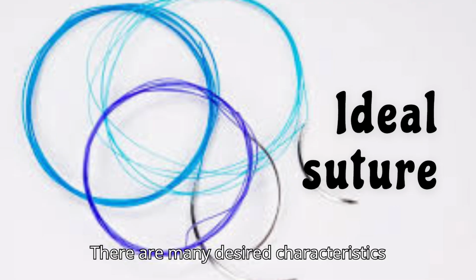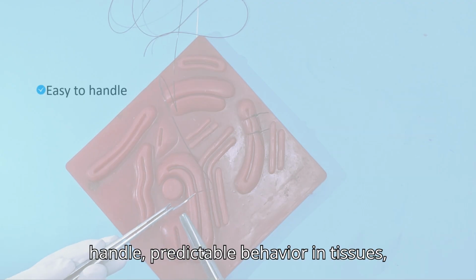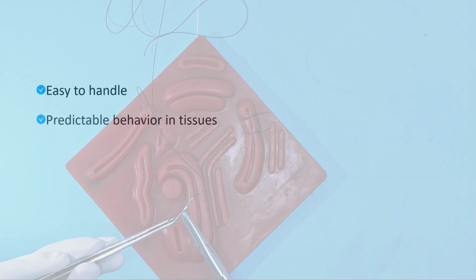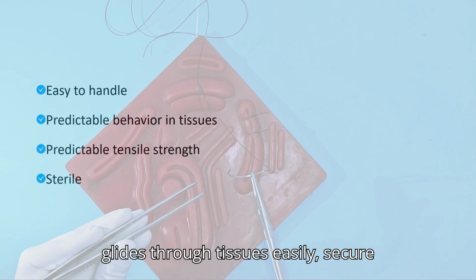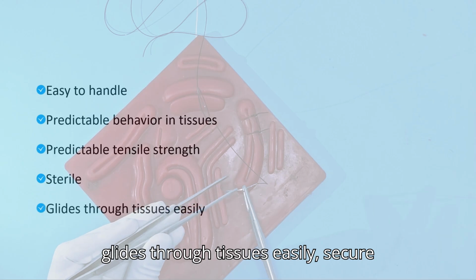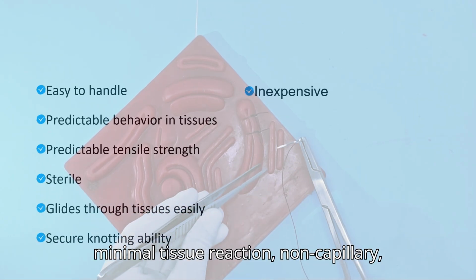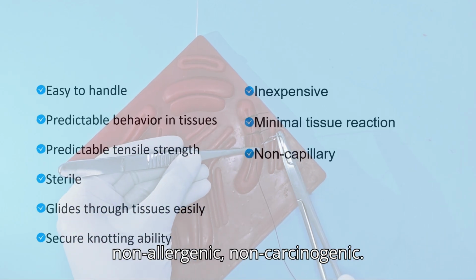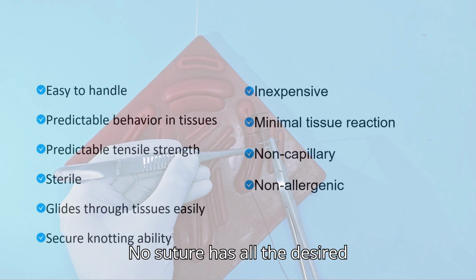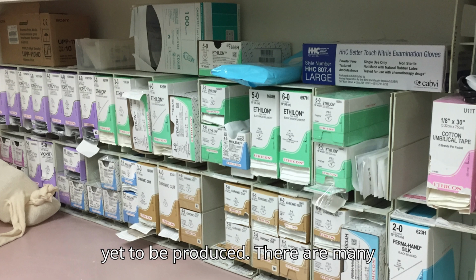There are many desired characteristics for a suture material, like easy to handle, predictable behavior in tissues, predictable tensile strength, sterile, glides through tissues easily, secure knotting ability, inexpensive, minimal tissue reaction, non-capillary, non-allergenic, non-carcinogenic. No suture has all the desired characteristics, and the ideal suture is yet to be produced.